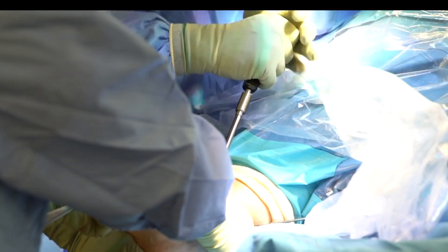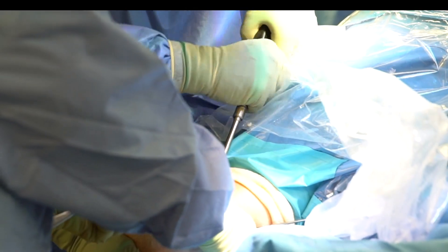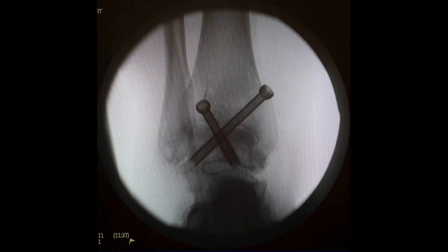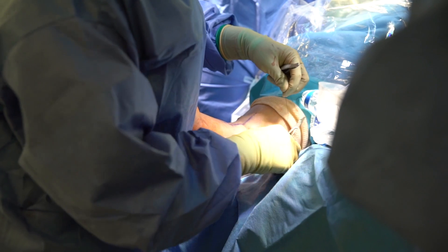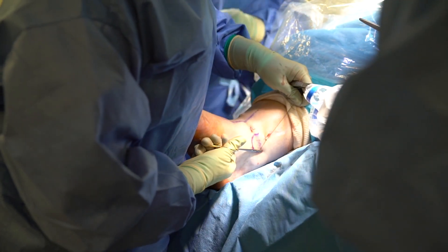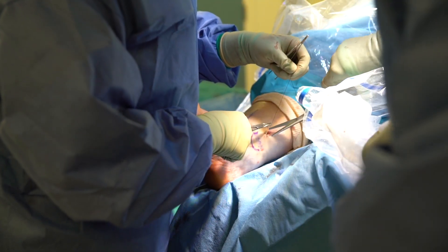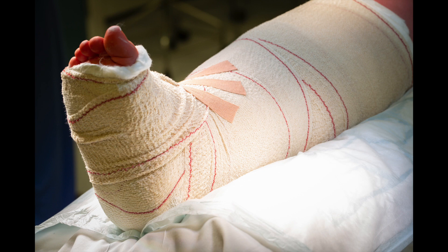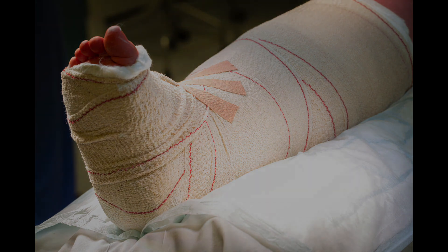After drilling, the screws are inserted — cannulated, partially threaded 6.5 mm screws, one medial and one lateral, which is a very good configuration. Iodine dressing is applied. Patients are placed in a backslab for 2 weeks, followed by non-weight-bearing plaster for 4 weeks, then weight-bearing plaster for 6 weeks.